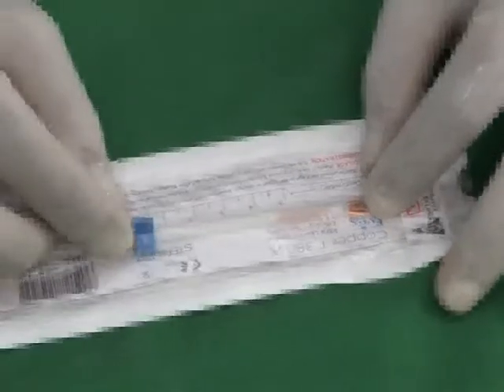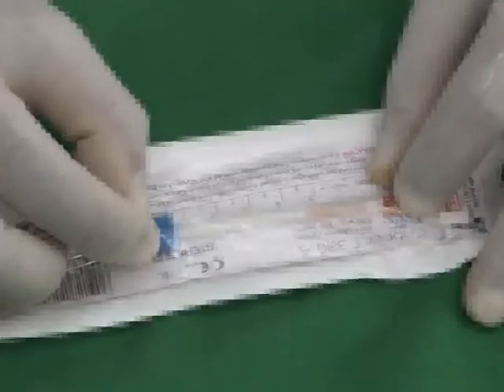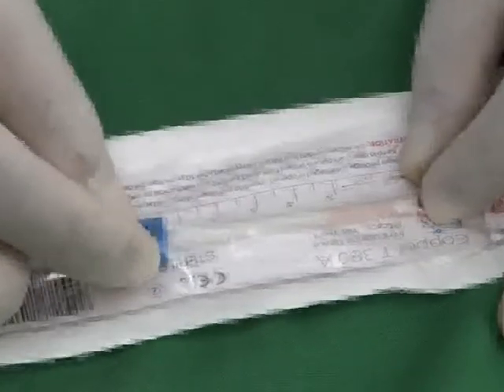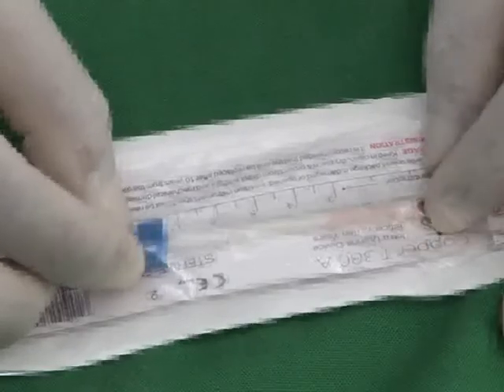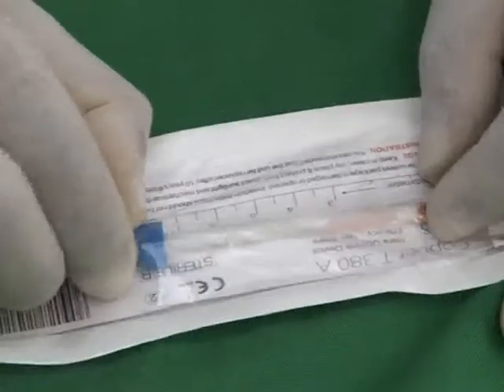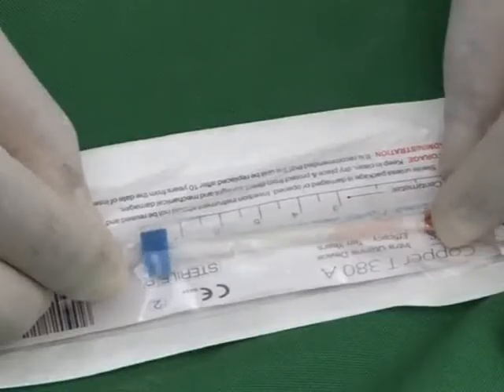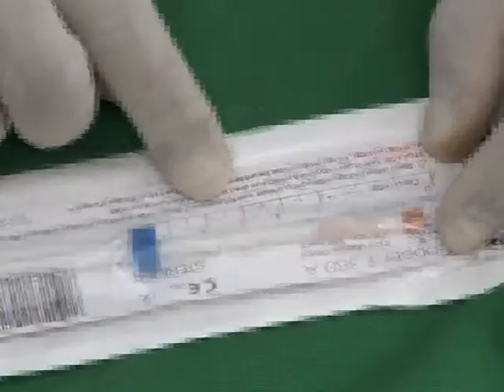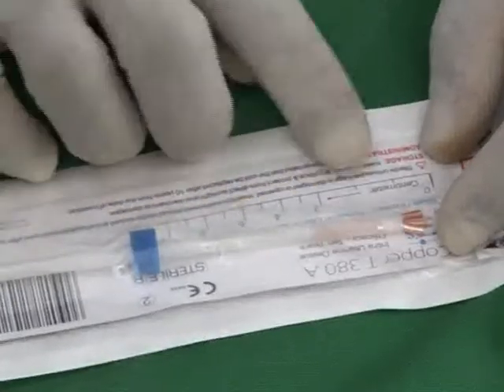Once you have done this, you need to move this movable part, which is blue in color, depending on the length of the uterine cavity you measured earlier. You have to use the scale shown on this paper to adjust the length.